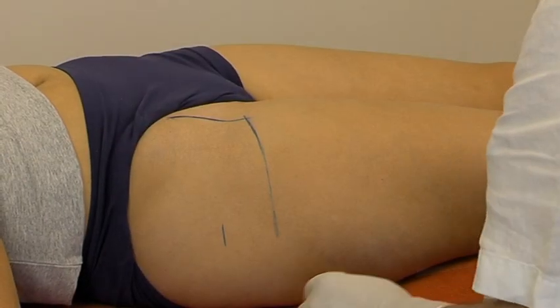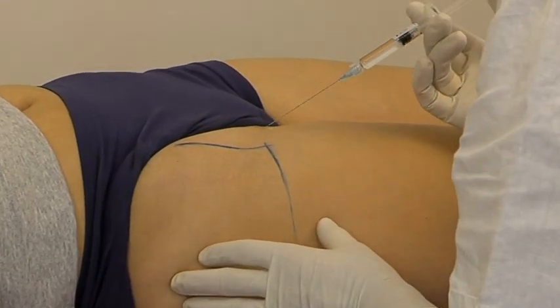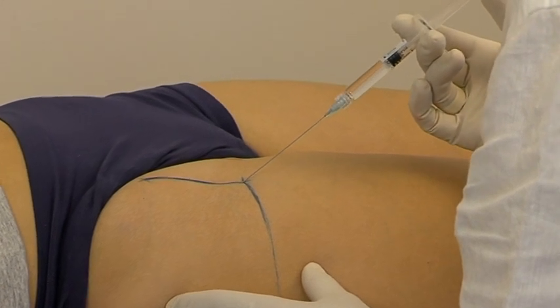The needle is inserted at an angle of 45 degrees at the crosshairs in an upper direction, which is well lateral of the femoral nerve and vessels.